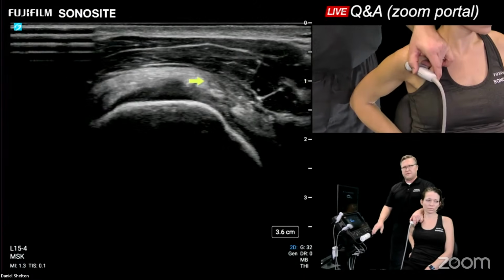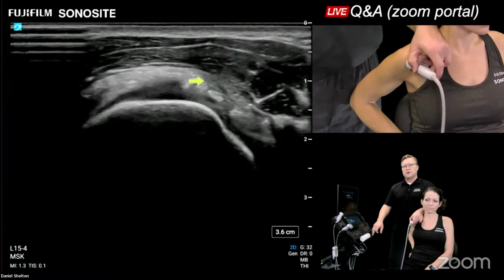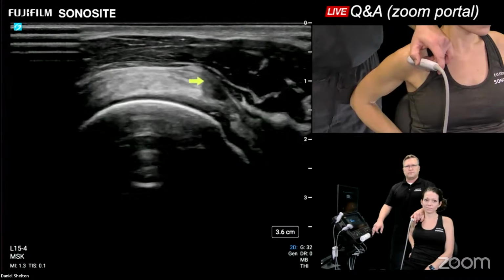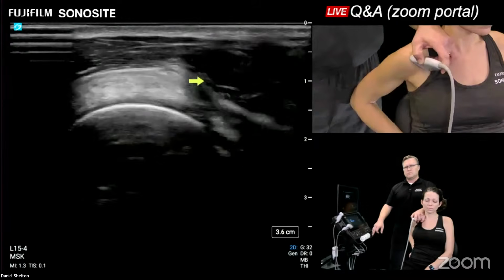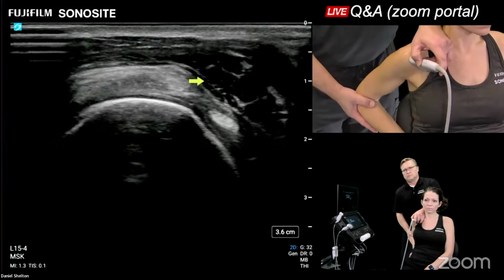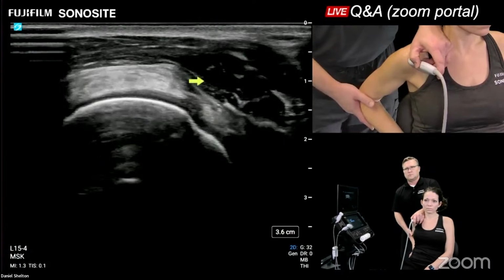I hope that answered the question. If it didn't, clarify. It's okay. We're here for you. We have time. Yeah, that's right. Anybody else have any other questions? Go ahead and enter them into the Q&A box there. Daniel, are there any other exams where it's helpful to have that kind of side-by-side view?